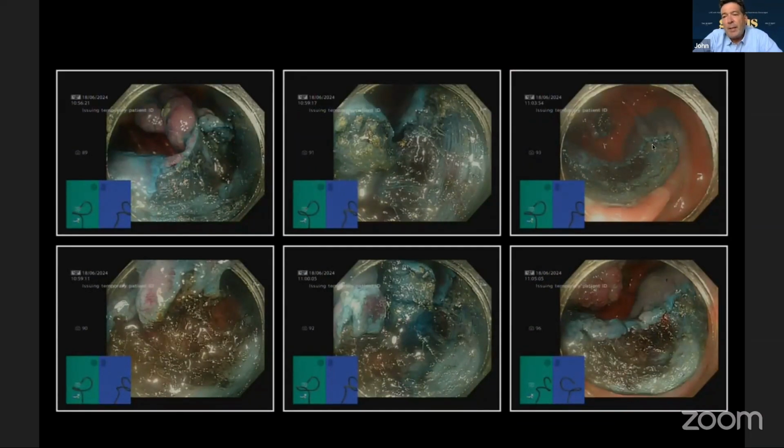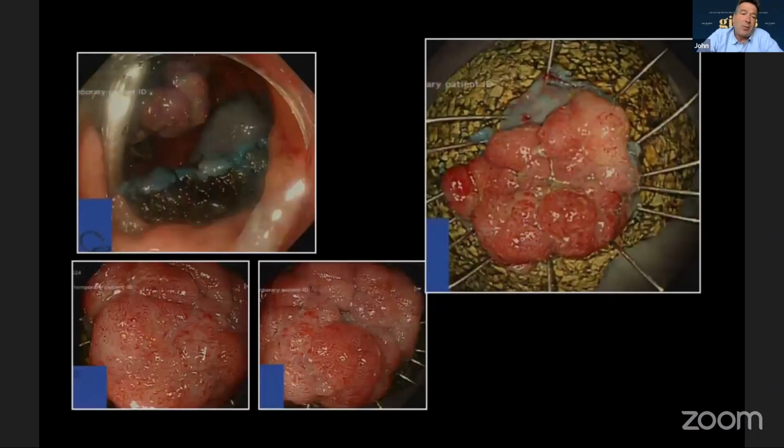And then we eventually took it off, and you can see here, this is the area that was very vascular and bleeding, and you look at the rest of it, beautifully white, nice muscle, and you've got all this hemosiderin staining at the bottom where you've had a bleed into the space. And you really want to avoid this because it's very difficult to define the planes once you get bleeding. So, as you learn, try and not have bleeding because it just makes life difficult. And then this was the lesion. And this was the big nodular bit with the vascular bit underneath, but it looks benign.